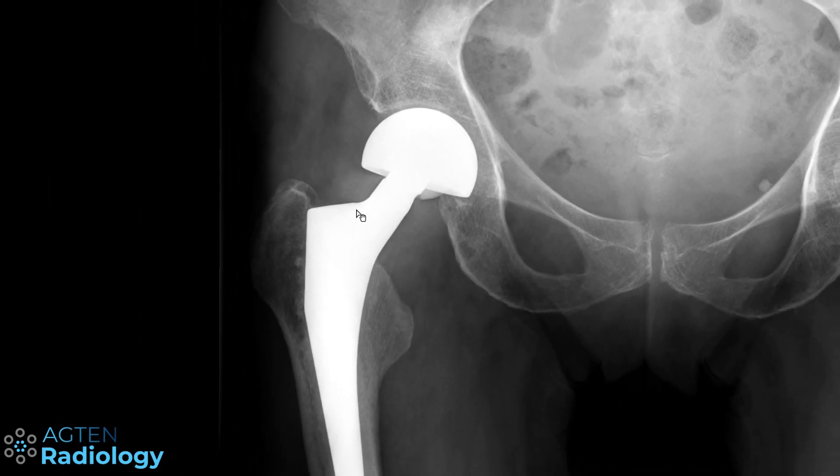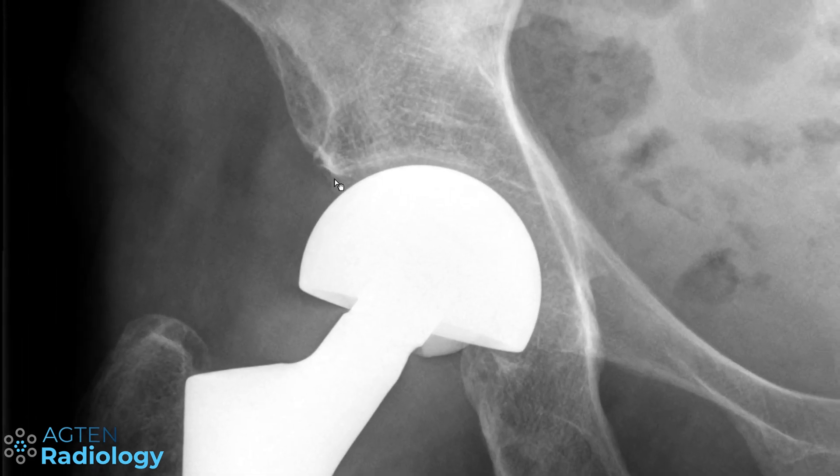Within hemiarthroplasty there are two different types. This one is a bipolar hemiarthroplasty, meaning you've got the stem, then the round head of the prosthesis, and then a second component that articulates with this smaller head inside. This outer component then articulates with the native acetabulum — so it's a bipolar hemiarthroplasty with movement between the small head and the outer head, and between the outer head and the acetabulum. You can easily identify these by seeing the acetabulum spared, with the lucency of normal cartilage still present.